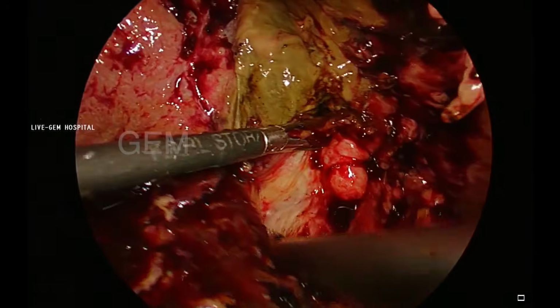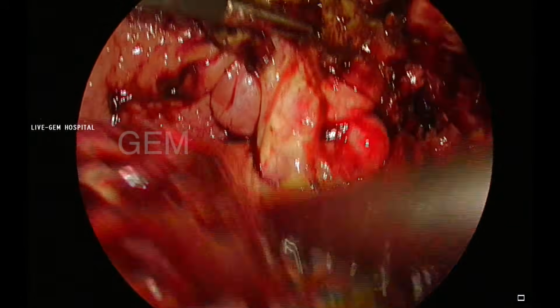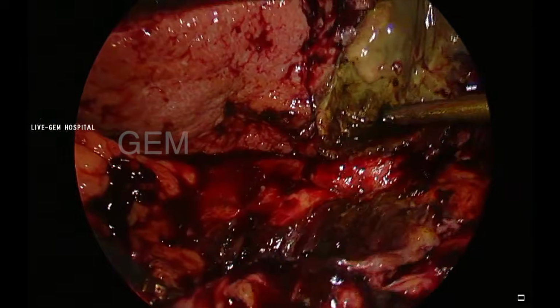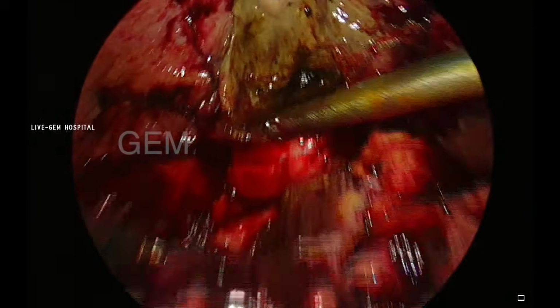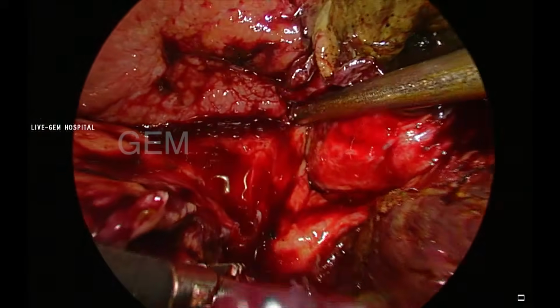So now you could see some of the anterior wall we are able to find. That is the infundibular region. The anterior wall is a little bit, it's not gangrenous. The mucosa got gangrenous, but the serosa looks pink. Some blood supply is still there.